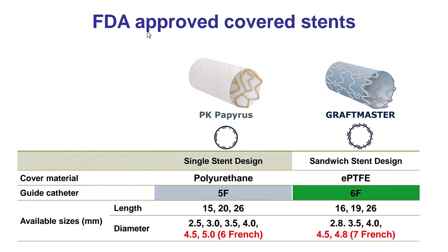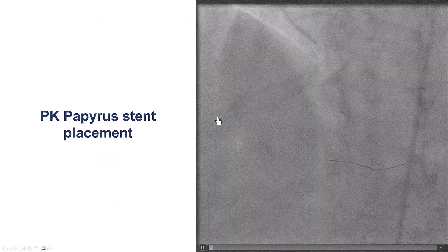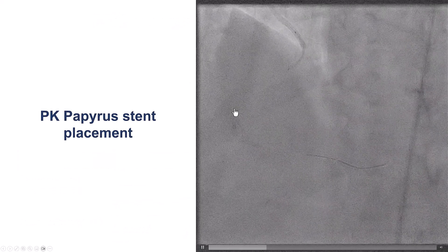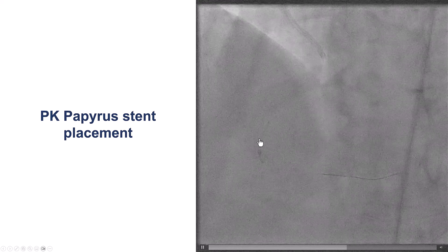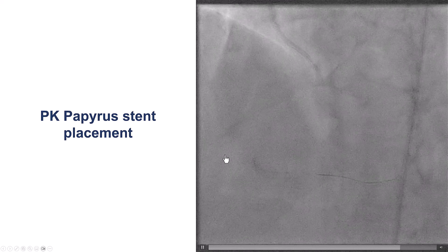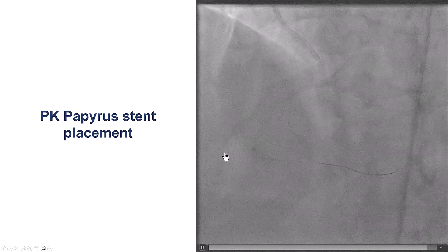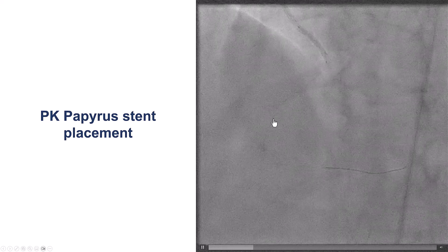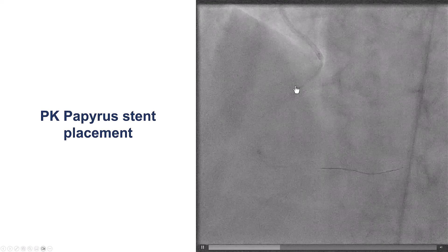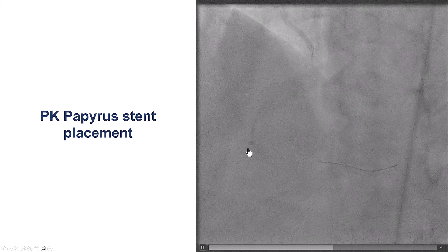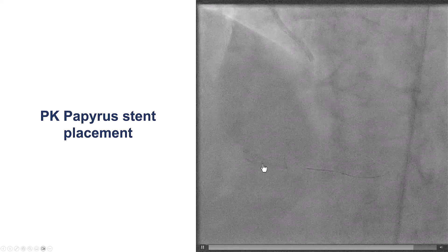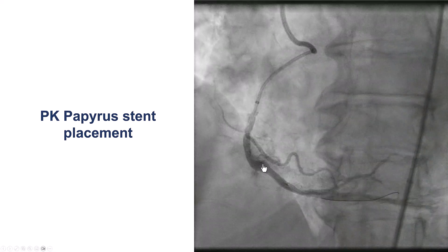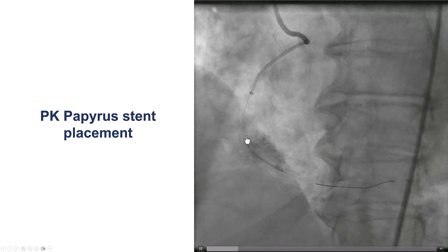These are the covered stents for sealing this perforation, with PK Papyrus being the most commonly used. After we continued to have staining and extravasation, we decided to place the Papyrus. Covered stents can be challenging to deliver, but fortunately, having the guide extension essentially all the way to the distal RCA, we were able to successfully deliver a 3.5 by 26 millimeter PK Papyrus stent.